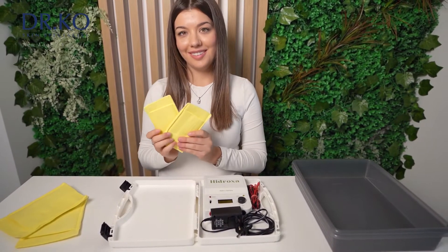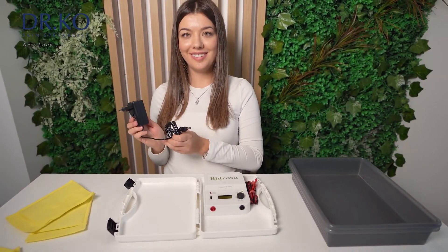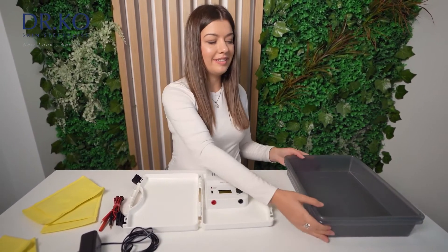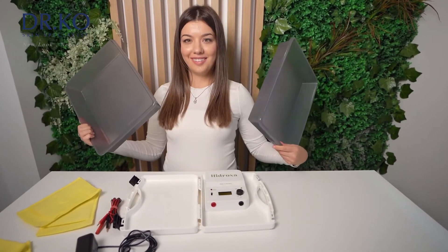In the package you will find our device, Hydroxa SE20, large and small pair of electrodes for the treatment of hands, feet and armpits, the charger, rechargeable batteries, as well as two plastic containers.